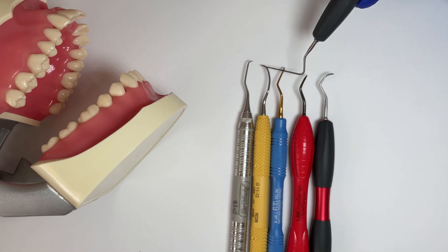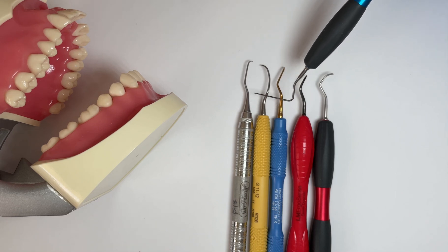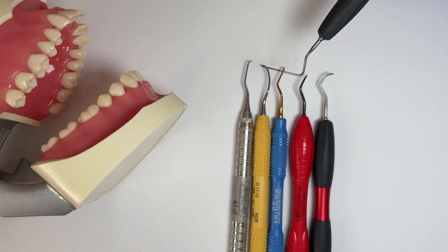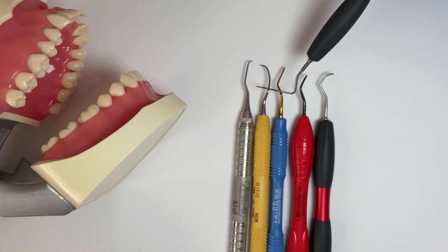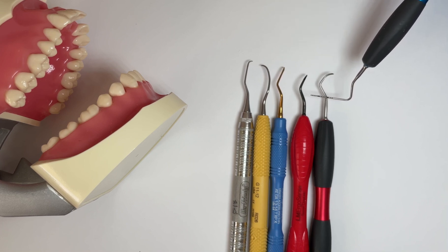Why is the functional shank significant? If we have a longer functional shank, those are going to be instruments we use on root surfaces — we need to be able to access those deep pockets. Instruments with a shorter shank might only be good for crown surfaces of instrumentation.